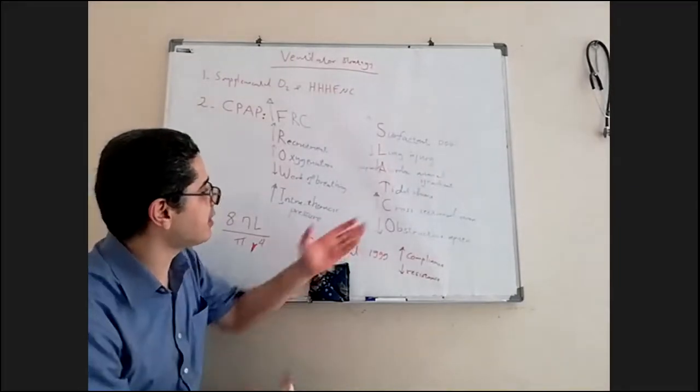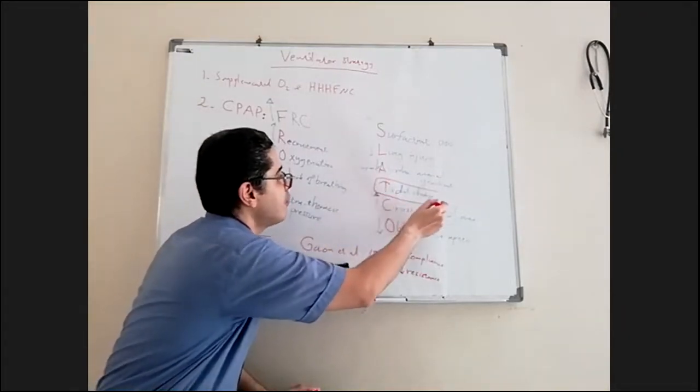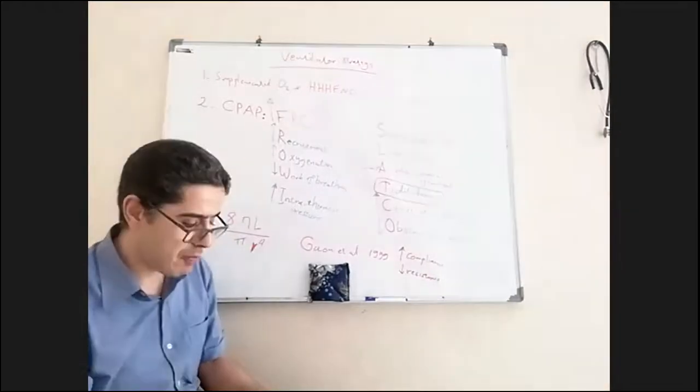And that's why tidal volume improves. Tidal volume improves when you see that, because it will improve compliance. When you have better compliance, you have better tidal volume.